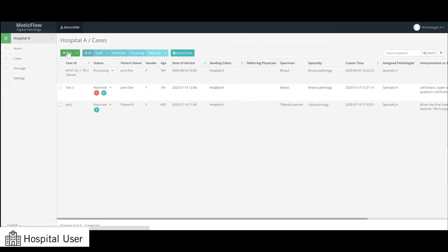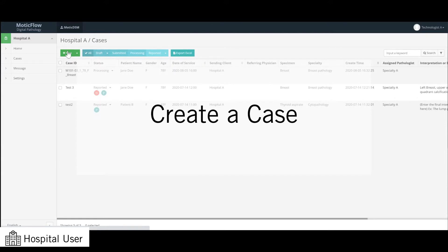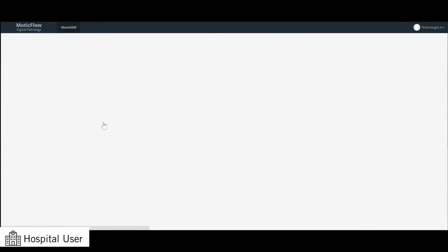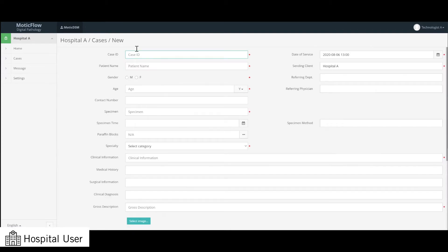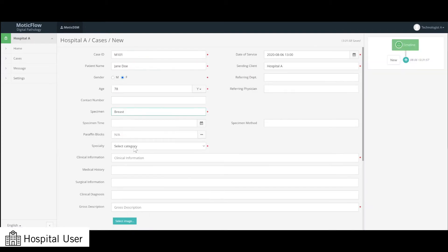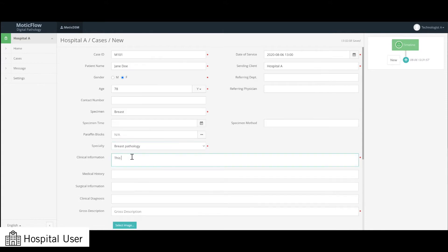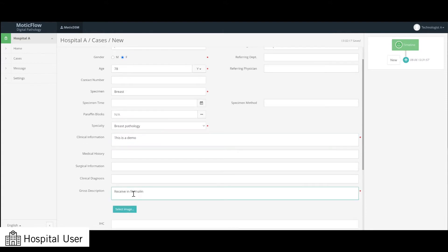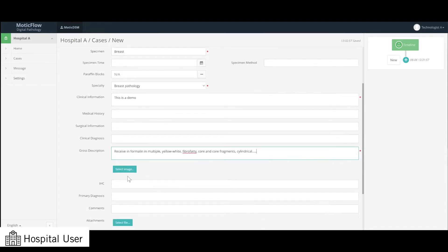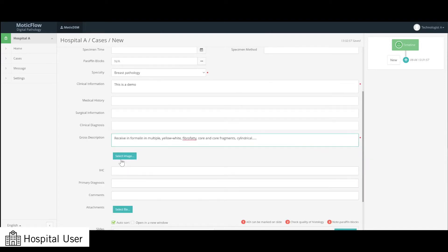Starting as a hospital user, easily create cases from scanned whole slide images. To create a new case, select New in the top left corner. From there, enter in your case details, then fill out the required sections, including the gross image and image descriptions.